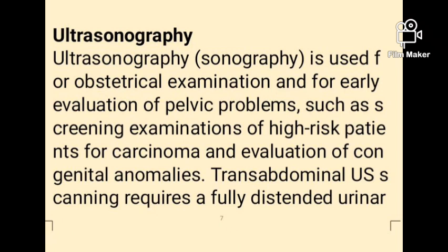Next, I really need to talk about ultrasonography, also called sonography, an imaging modality used for obstetrical examination and for early evaluation of pelvic disorders such as some cases of cancer and also congenital anomalies.